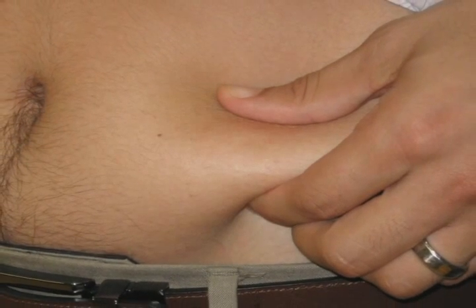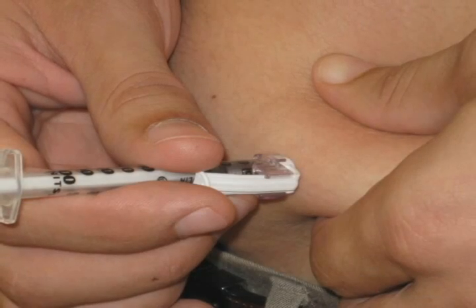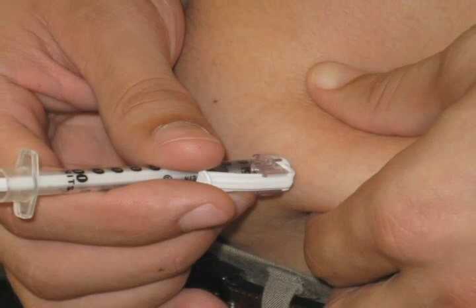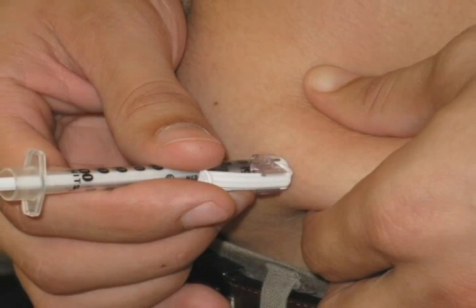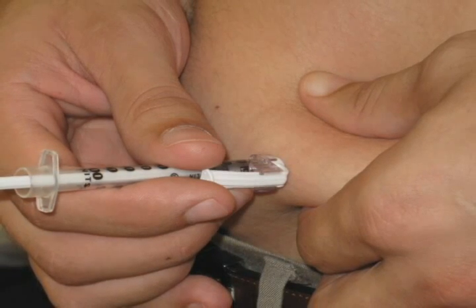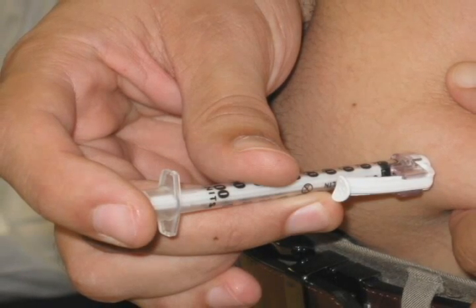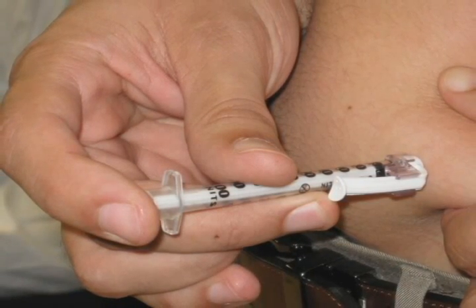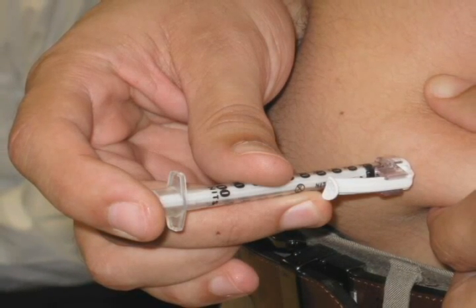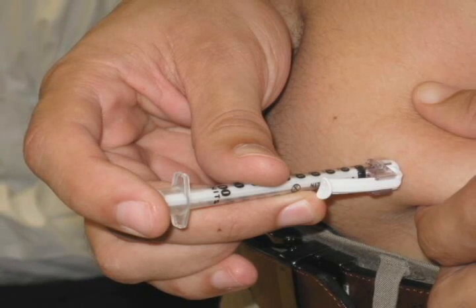Pinch a large area of skin where you wish to give your insulin dose. Push the needle all the way into the skin at a 90 degree angle. If you are a very thin person or a child, the needle can be injected at a 45 degree angle. With the needle in the skin, slowly push the plunger all the way down and release the pinched skin after all the insulin has been injected. Pull the needle straight out of the skin. Do not rub the skin at the injection site.